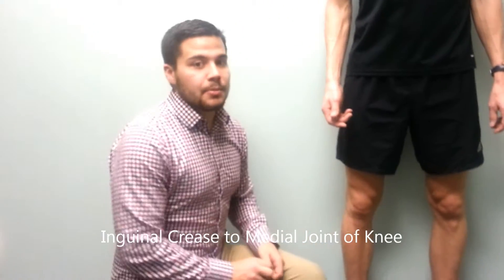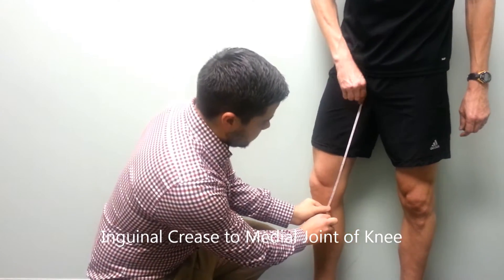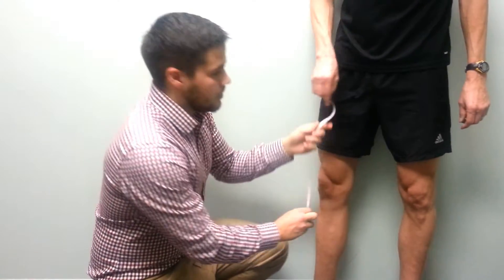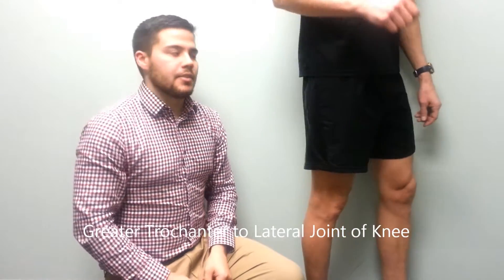Our first measurement is a length from the inguinal crease to the medial joint line of the knee. Our next measurement is from the greater trochanter to the lateral joint line of the knee.